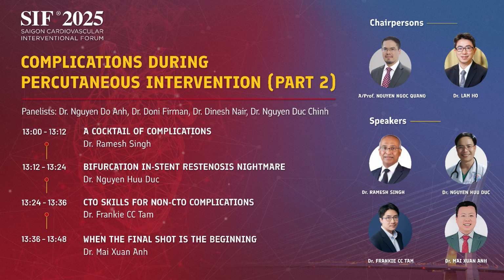I'm just saying I'd try and put as little metal as possible. So I think I would have tried to go DEB personally if I could. And using the normal parameters, it doesn't recoil more than 30%, and the FFR was okay for the diagonal anyway.